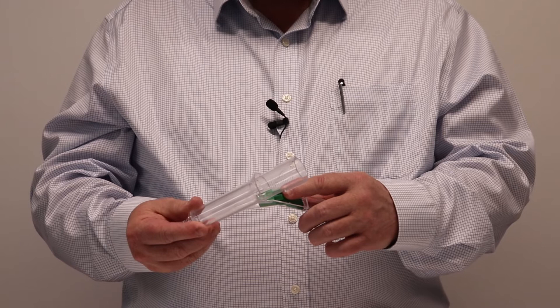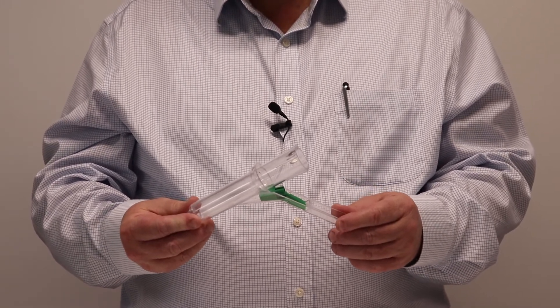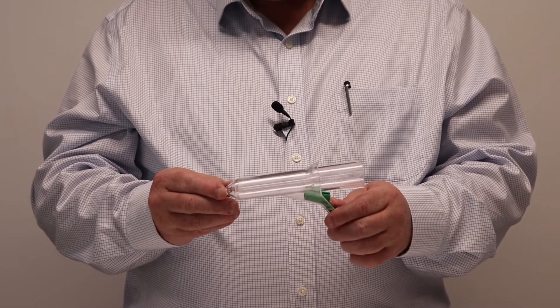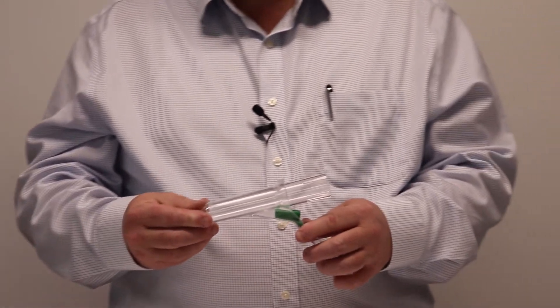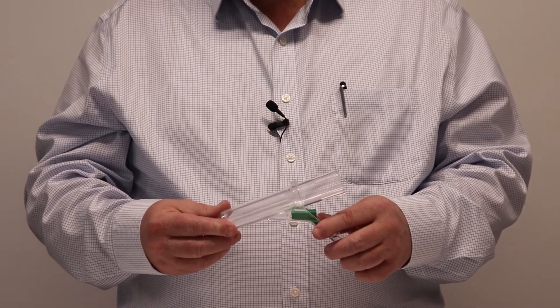Also, with the light source carrier, we can connect a variety of light sources and, importantly, the light source is focused at the distal end of the proctoscope. This throws the light forward into the rectal area and provides maximum illumination and visibility quality for the surgeon.